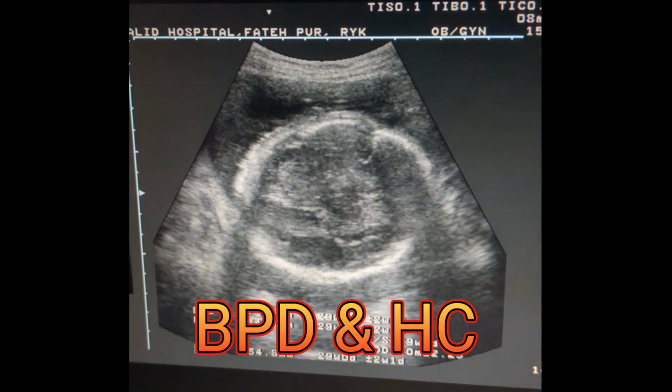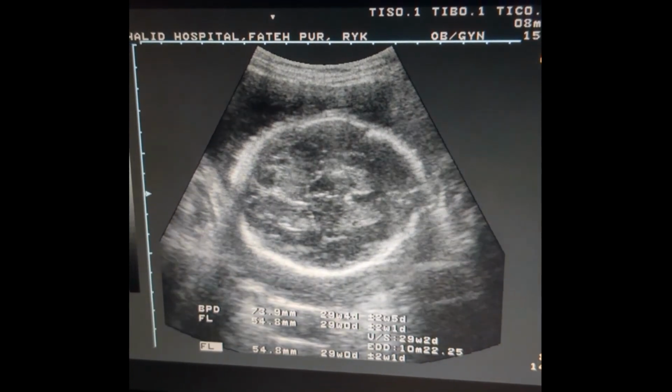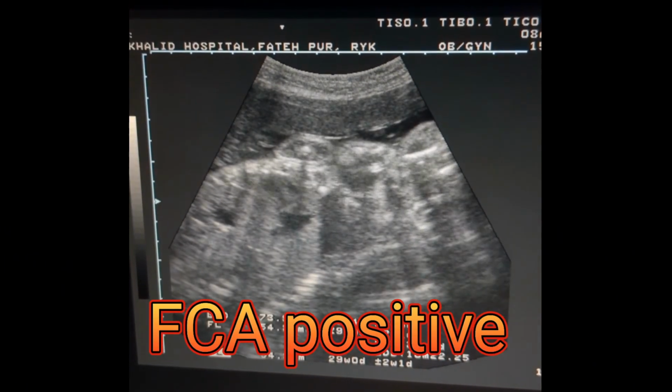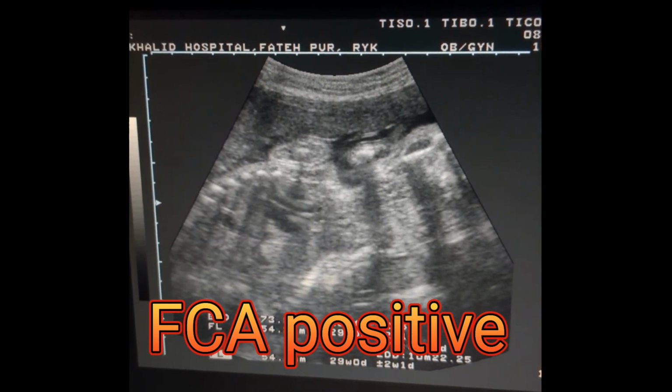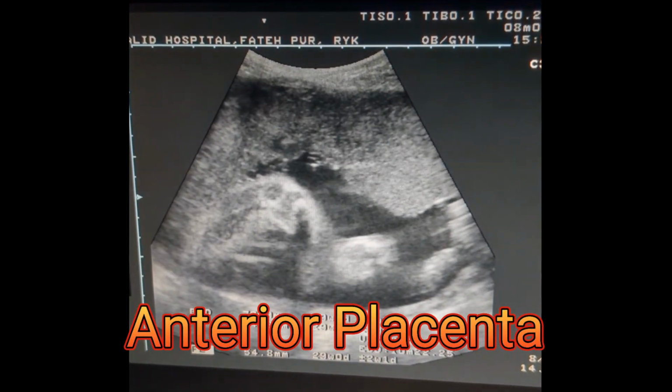This is a video of a quick OB scan. We can measure BPD and HC. Fetal cardiac activity is positive. A live fetus. Placenta is on the anterior wall.